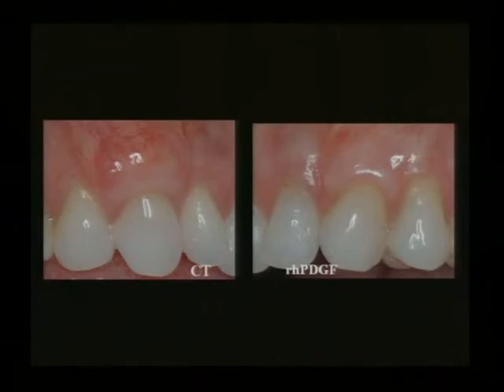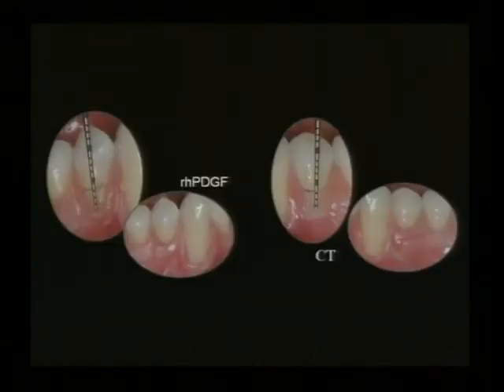We also included mandibular teeth in this study. They're more difficult to treat, especially teeth like this that have severe recession on adjacent teeth, and we're not treating those. So here, if you look, this bicuspid here is the final. Very nice result. Also, we got a nice result with the connective tissue also.